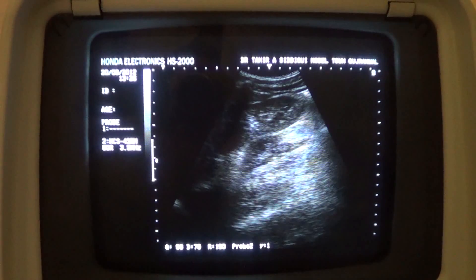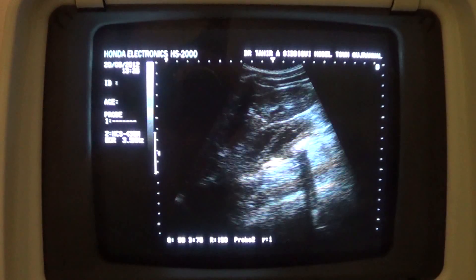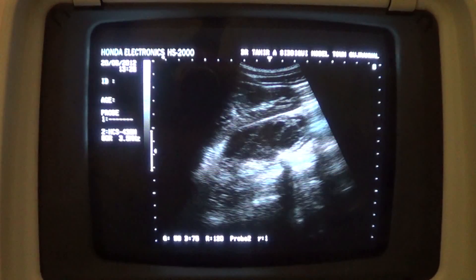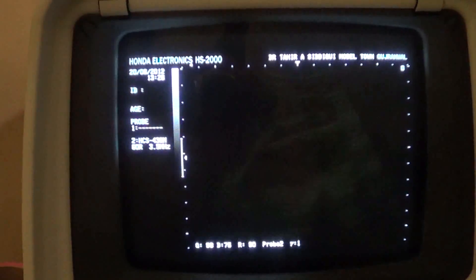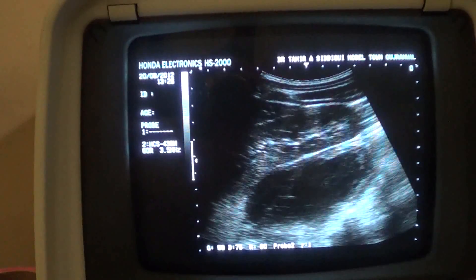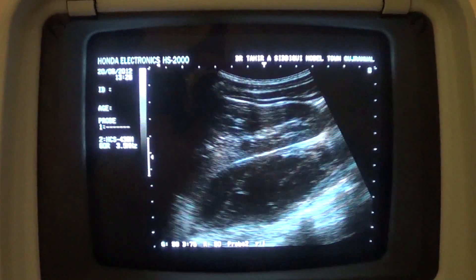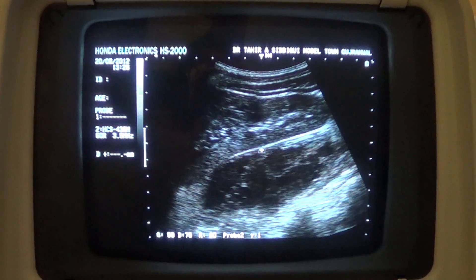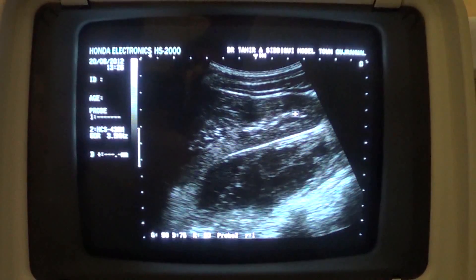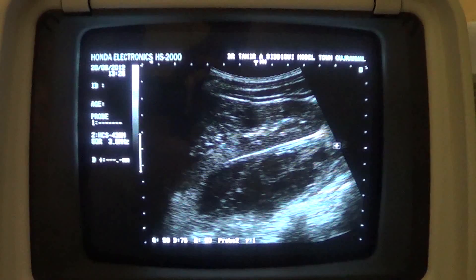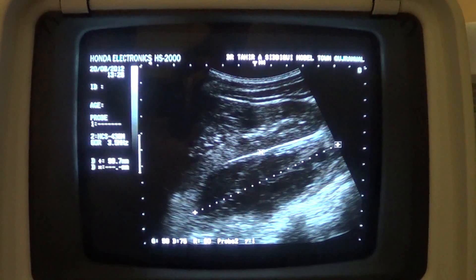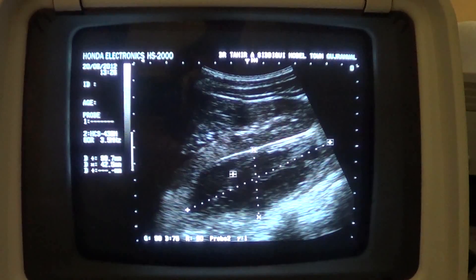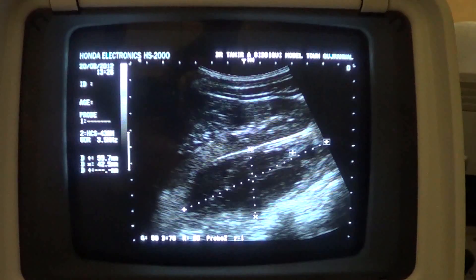But as I move the angle of the probe towards the patient's left side, I see a thick-walled, echo-filled area in the region of the psoas muscle extending inferomedially. This is the thick-walled cystic area with internal echoes as well as multiple septas. These are septa — this is the thick septa, and this is the thin septa.